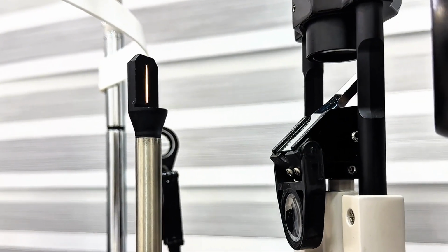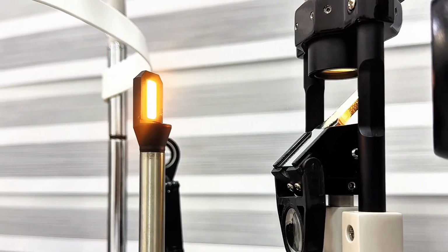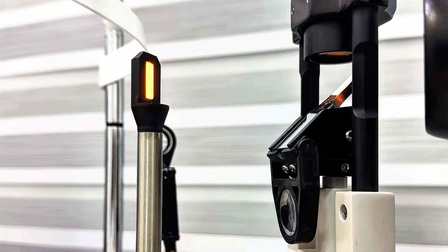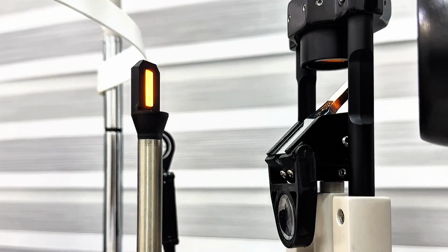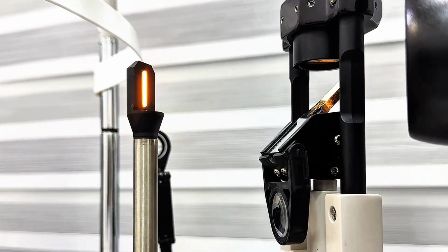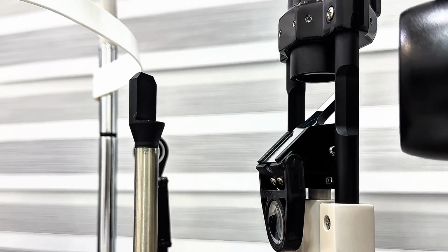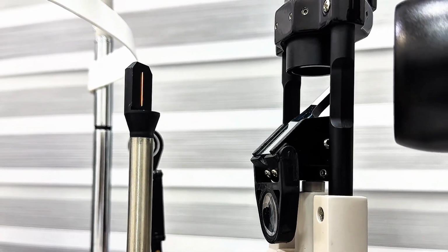But if you're going to use a wide beam for any test or for any procedure, make sure you reduce the intensity of your light. Alright, so let's turn on our illumination again for this technique. I'm going to turn it off and close my slit width adjustment knob. So I go ahead to turn it on again, and this is it.